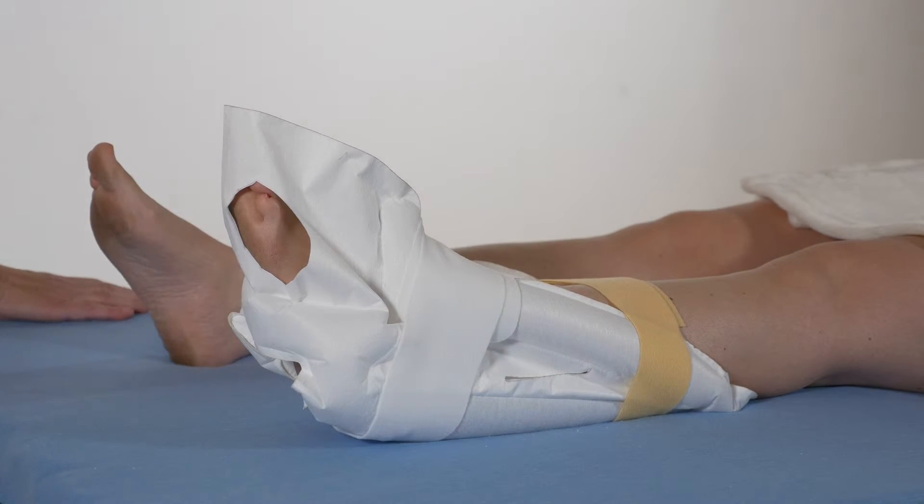When the patient lies in bed, it must be ensured that there is no overstretched knee.